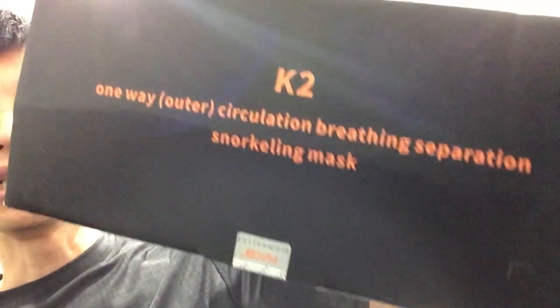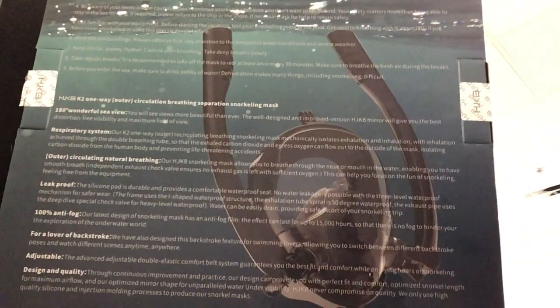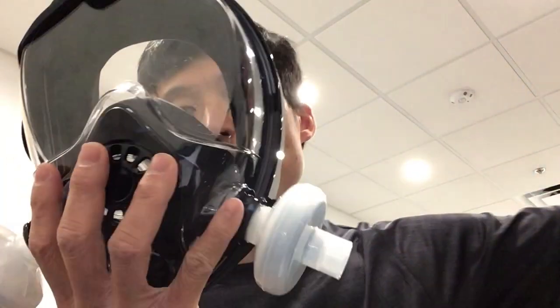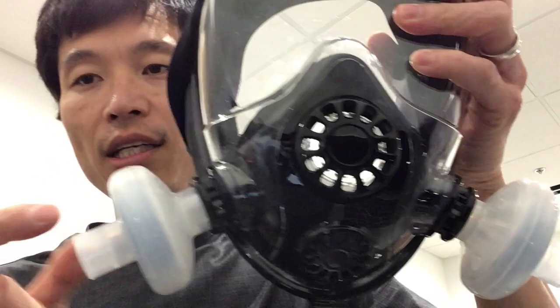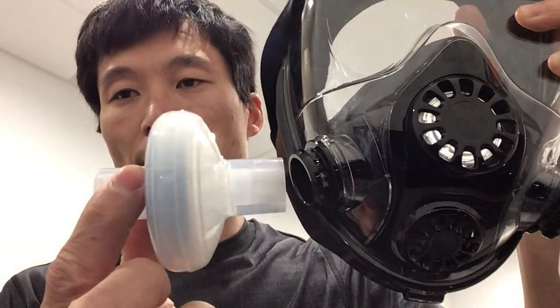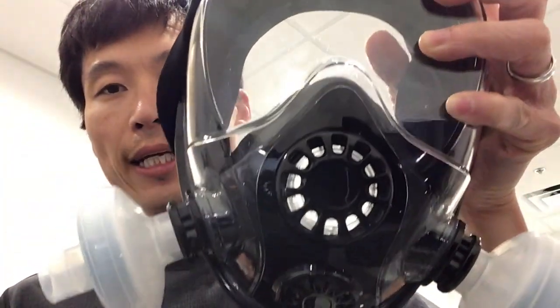I got it today. It's a K2 dual snorkel system. This is the picture of the snorkel basically fully assembled. What I found was that if you take the snorkel off, the 22 millimeter filter fits directly into the port.